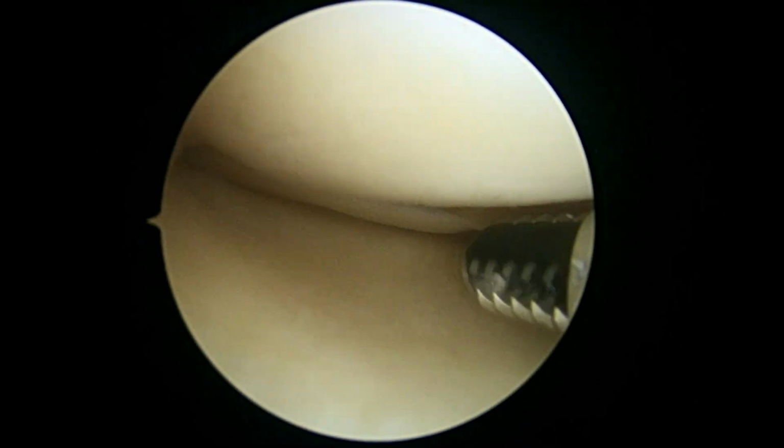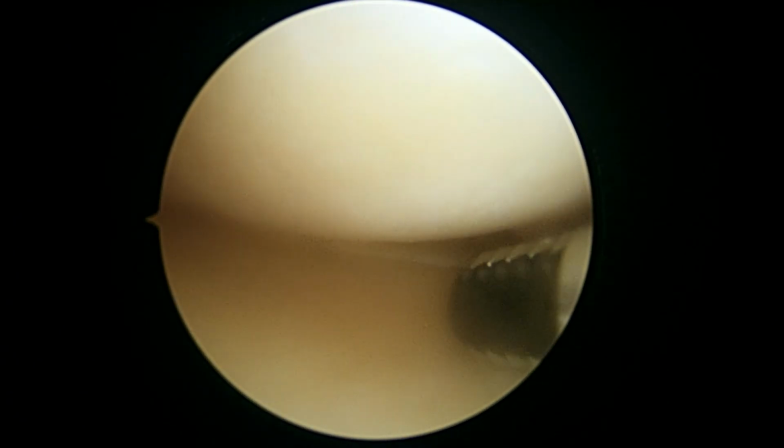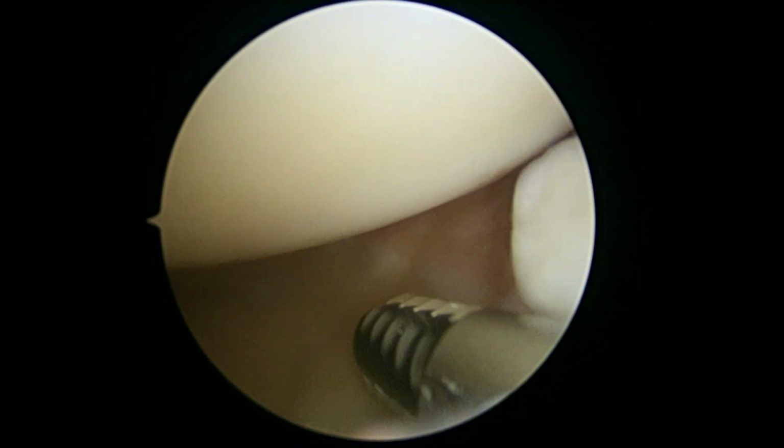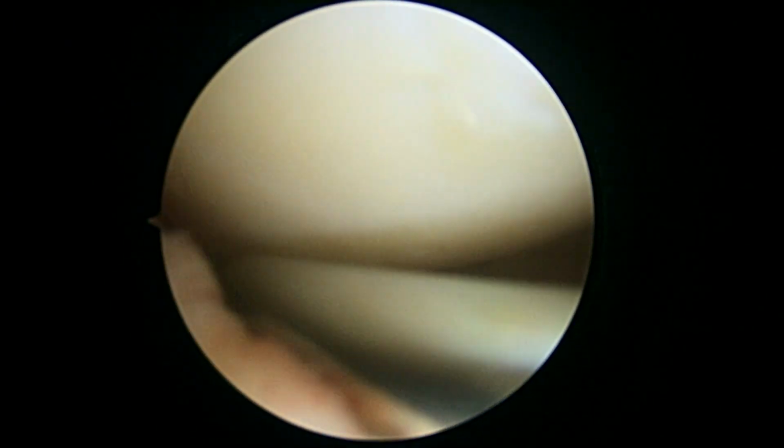make that even better. As far as the articular surface, the medial femoral condyle up at the top of the screen looks pretty good. There's our first loose body. Now we'll go ahead and put in a grasper, see if we can grab it. Sometimes we have to get a little tricky here.